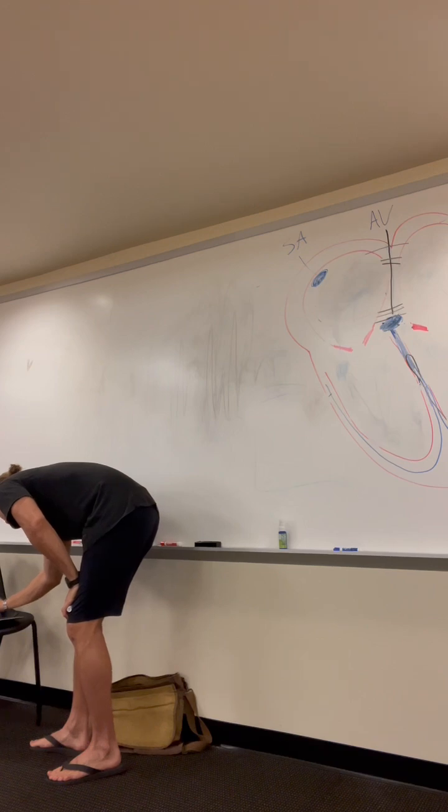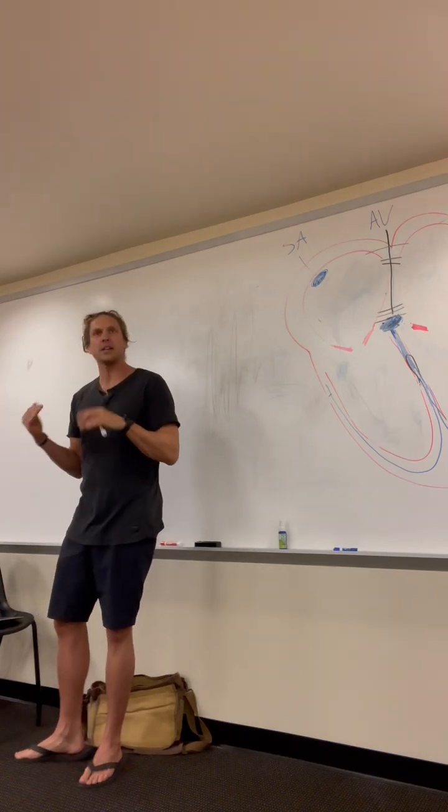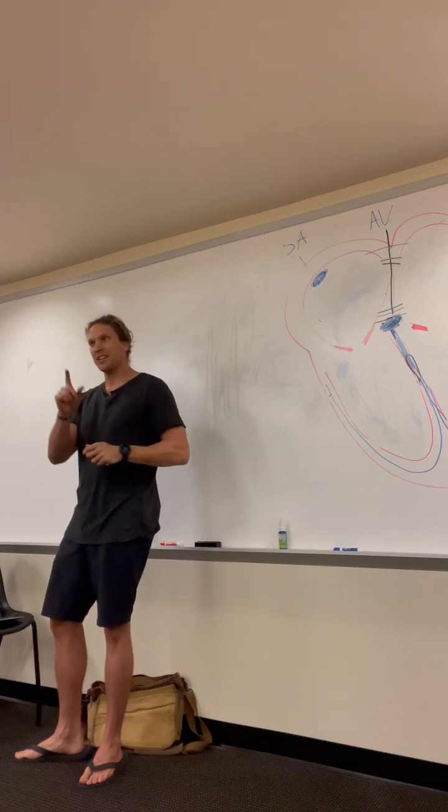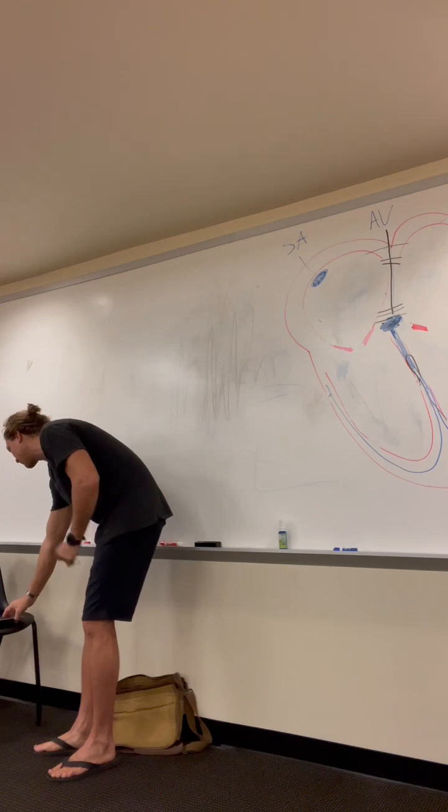Okay, 300, 150, 75. So this is between 75 and 60 heart rate. I know that, so I don't think this is a 6-second strip. That's what I meant to say. Thank you for telling me so I can clarify it.